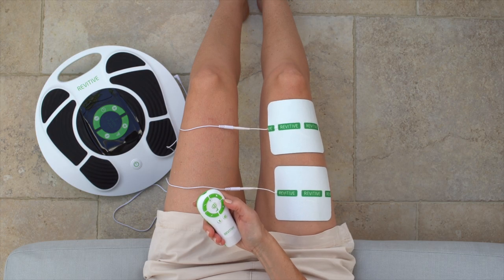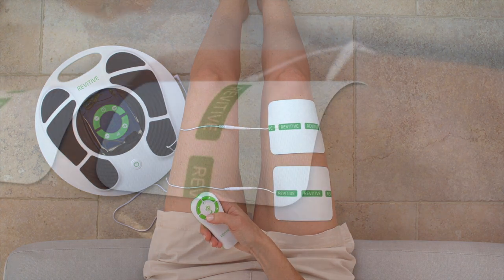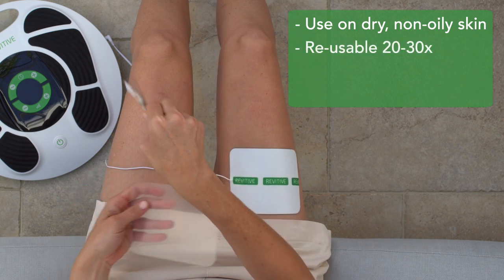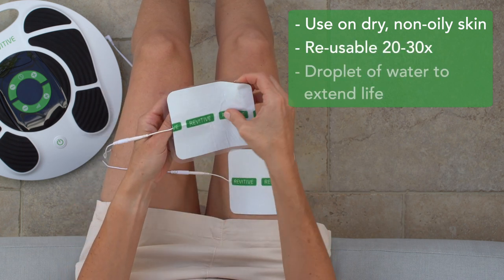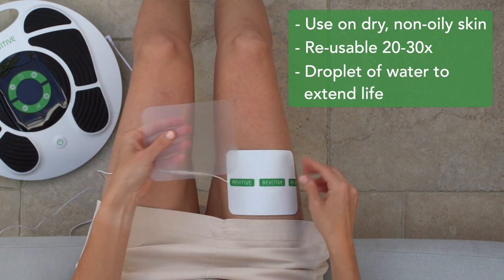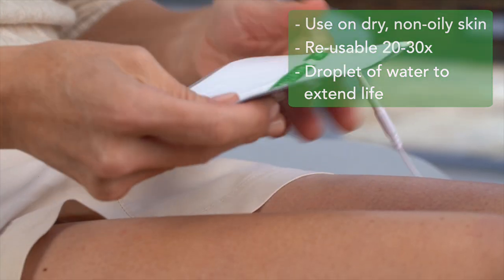Try to find a routine that works for you, perhaps using the arthritis pads Monday to Friday and not at the weekend. When used on dry, non-oily skin, the arthritis pads are reusable up to 20 to 30 times before needing to be replaced. If the arthritis pads start to lose their stickiness, just rub a few droplets of water into the surface to extend their life.